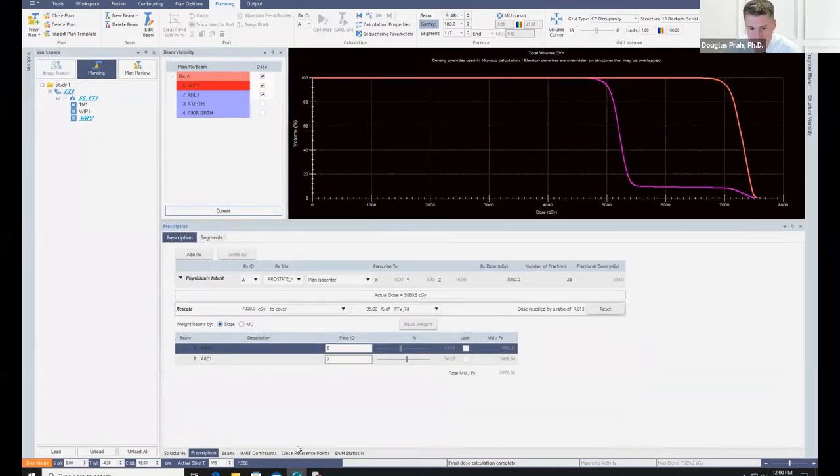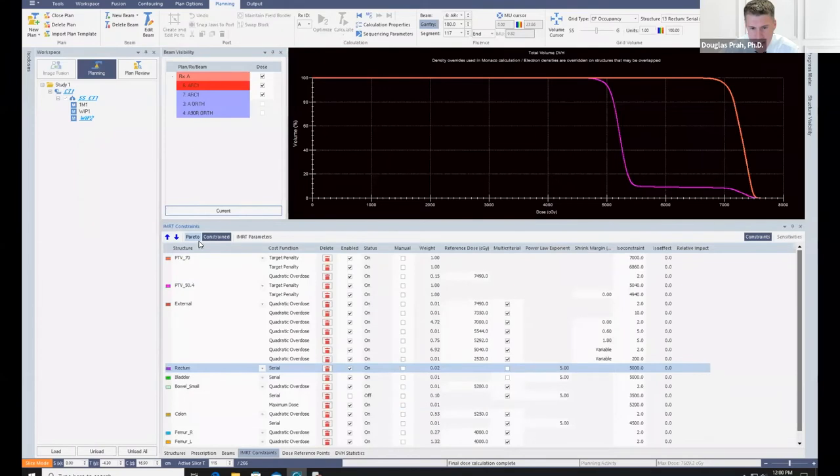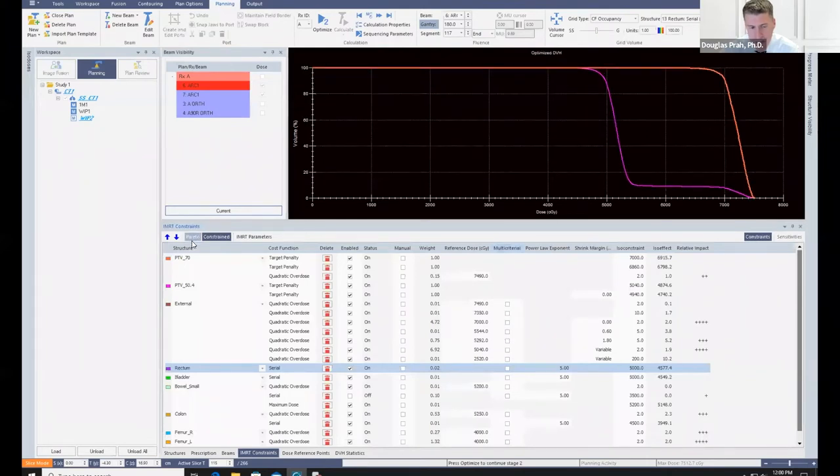So an alternative is, instead of scaling, we could just run this in Pareto. Turn MCO off and then run one more iteration. So that's kind of a nice feature: you can run stage two constrained with MCO on, and if you're not happy with the results, you don't have to throw away what you've been working on. You can switch the optimization mode in real time here. And you'll see I can just kick this off now and let this run.